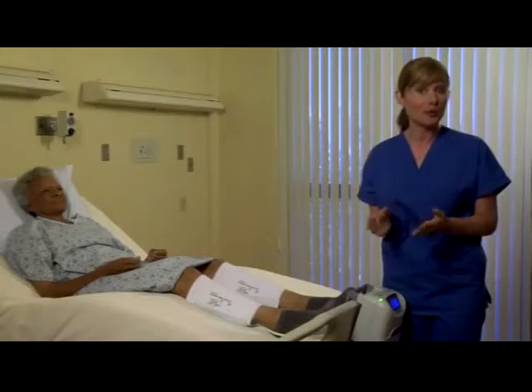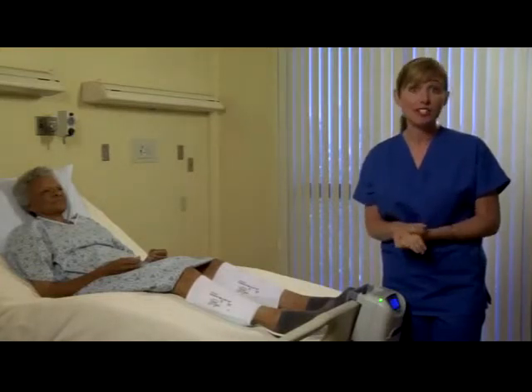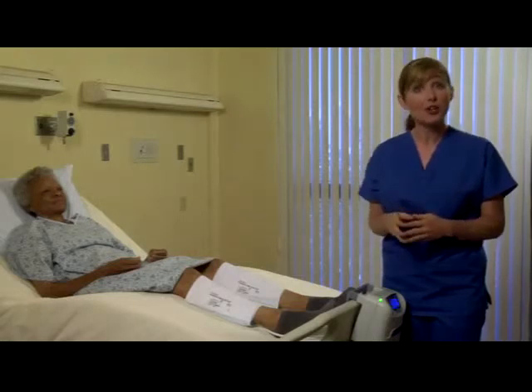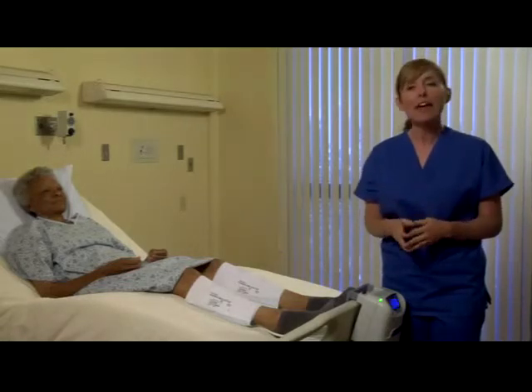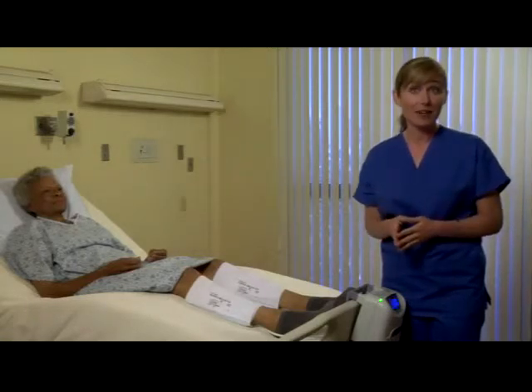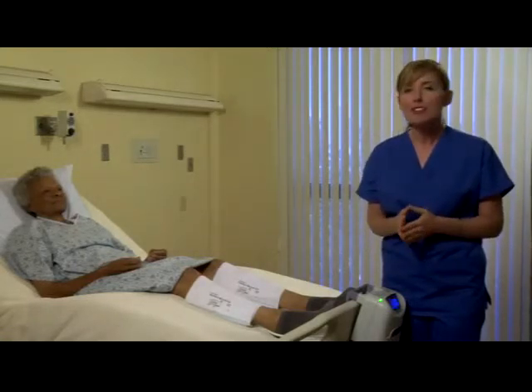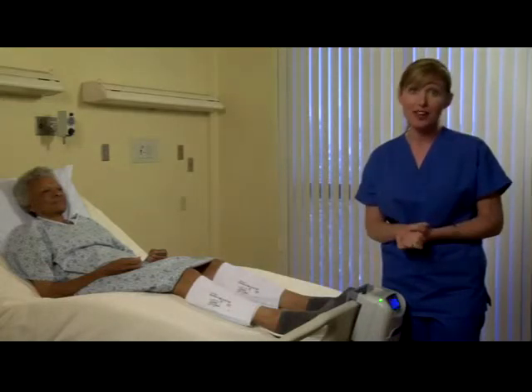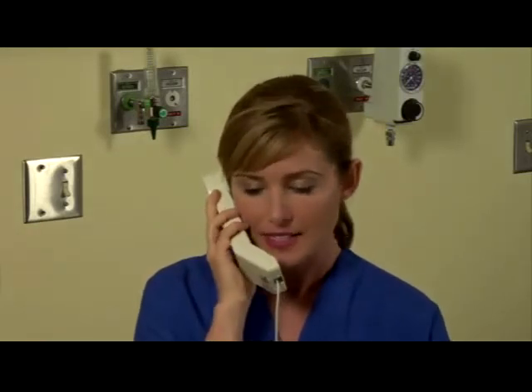If the check tubes alarm persists, then call DJO Customer Service to get a device replacement. If there is a more serious internal malfunction of the device, you may get a call for service alarm. You may press the on-off reset button to reset the alarm; however, this alarm will persist and the device will no longer function until the problem is corrected. In the unlikely event of this situation, you must call customer service to return the system and get a replacement.